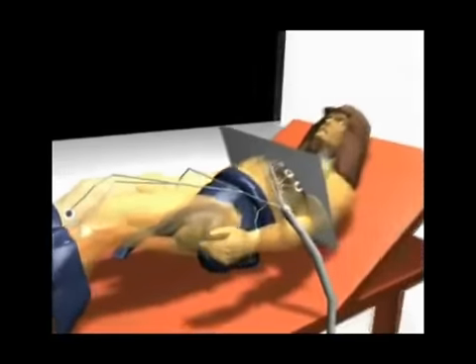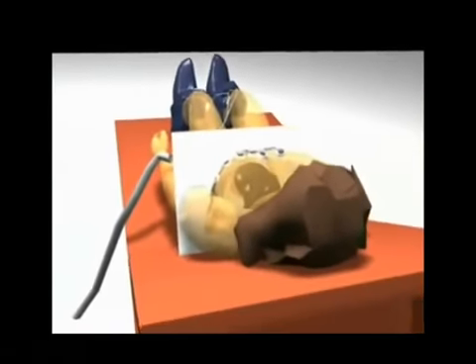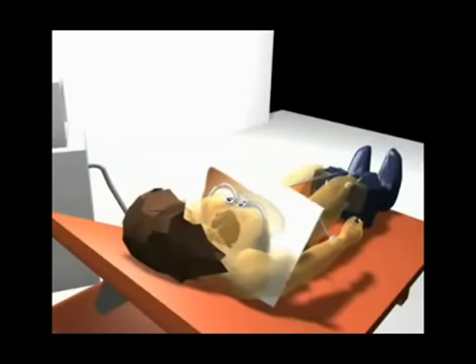These 6 chest leads examine the heart in the horizontal plane. In order to understand their view of cardiac electrical activity, we need to remind you of the position of the heart in the chest cavity. Let's examine a horizontal section of the chest taken at the level of the chest leads.